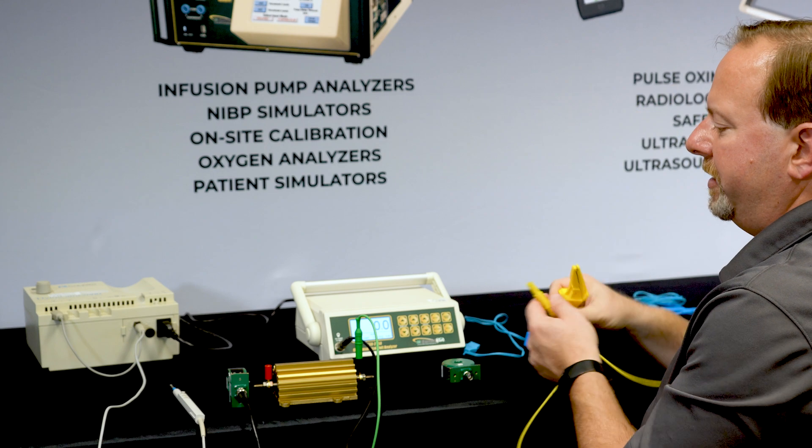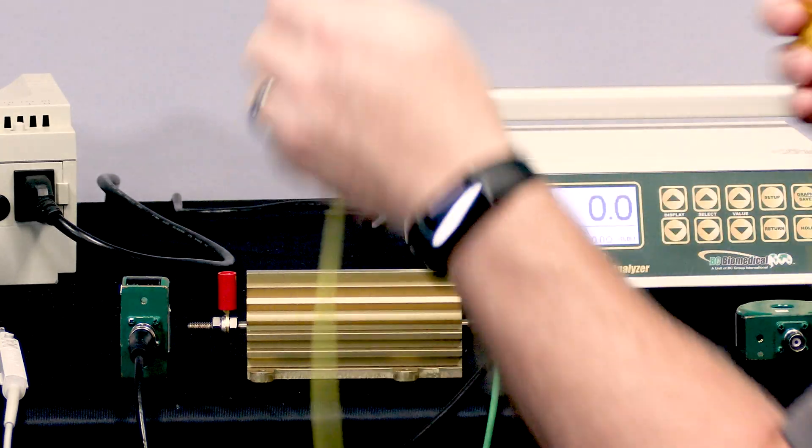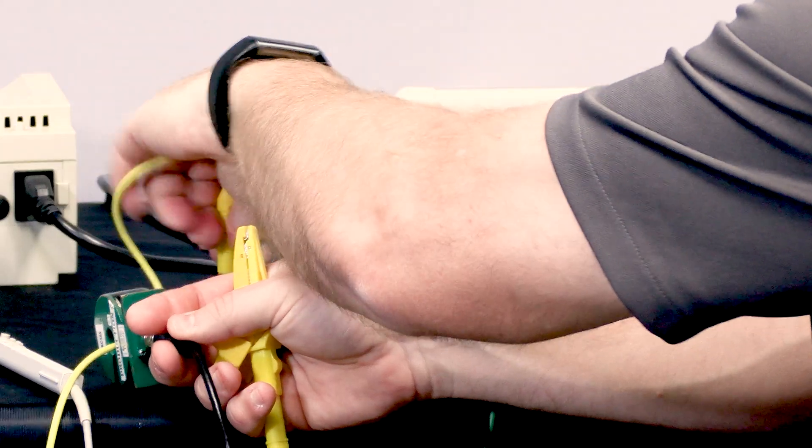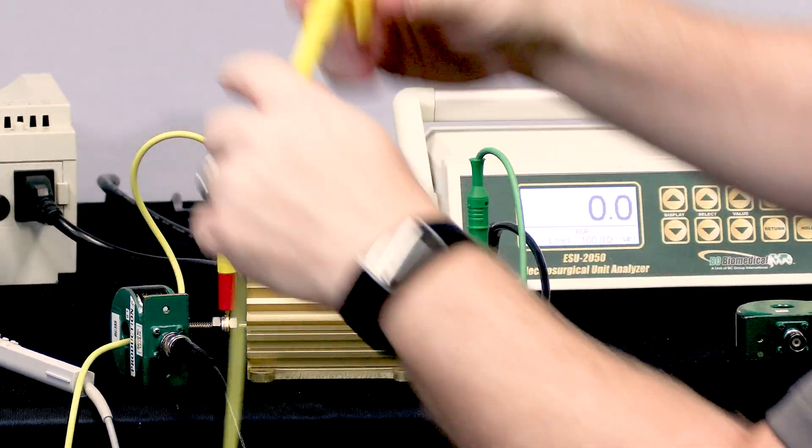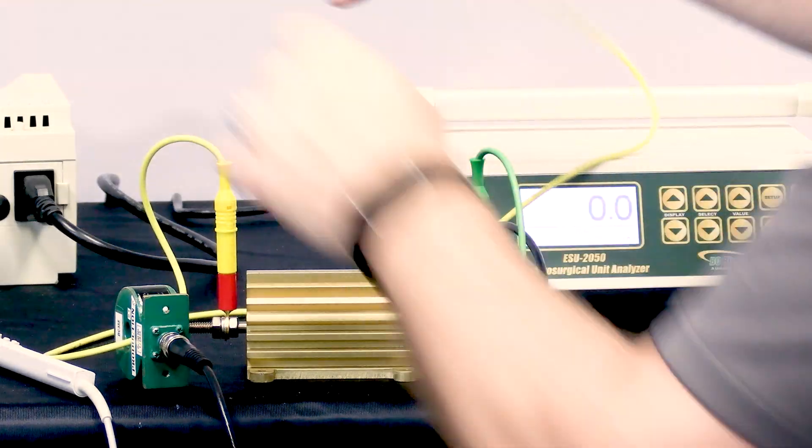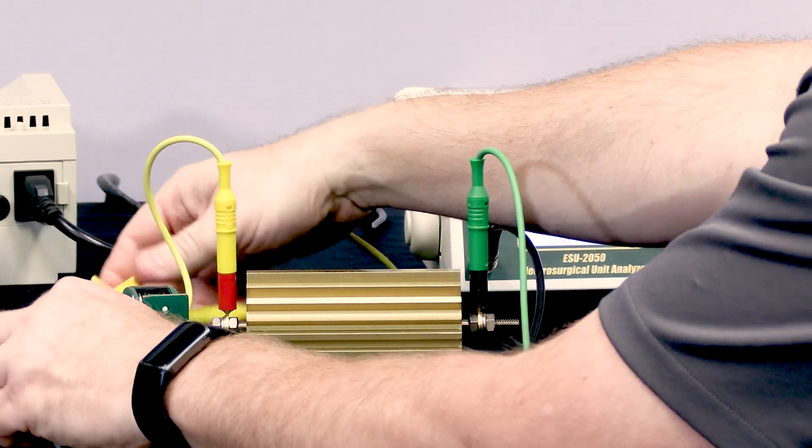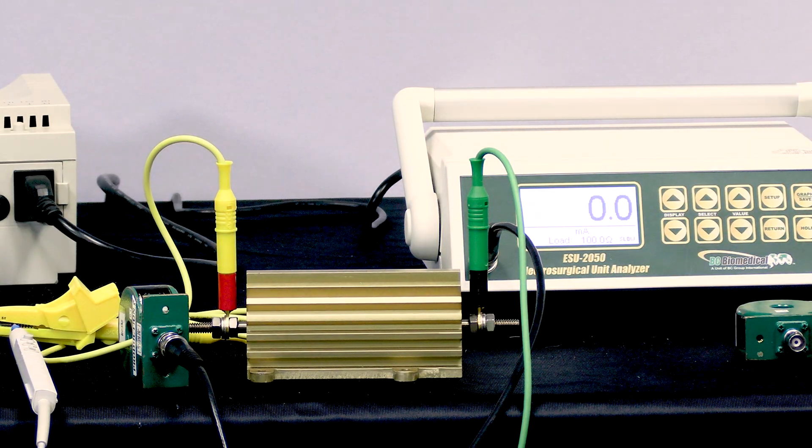The other output, the scalpel, is going to be connected to the current transformer and to the test load. The other end of that cable has an alligator clip that I'm going to connect to the scalpel electrode, and that's going to complete my circuit.